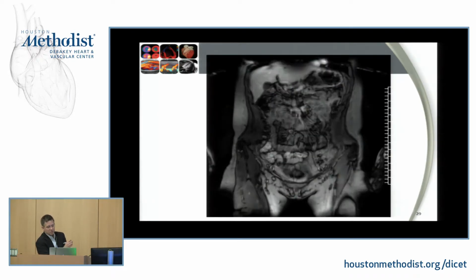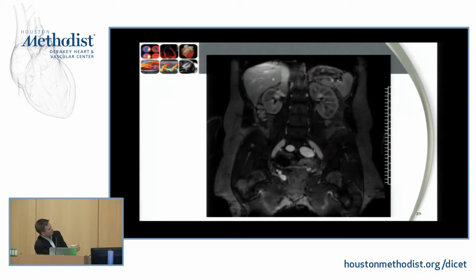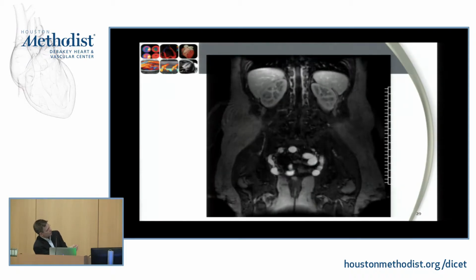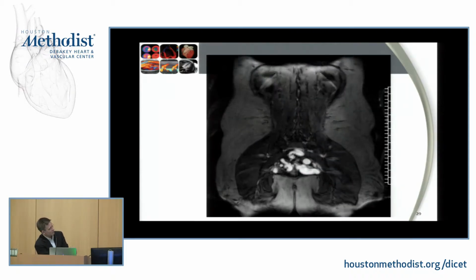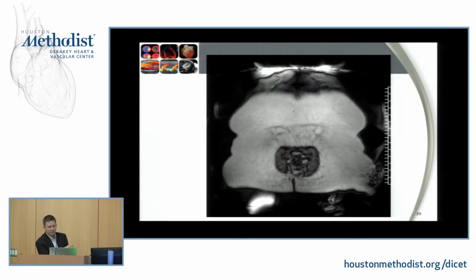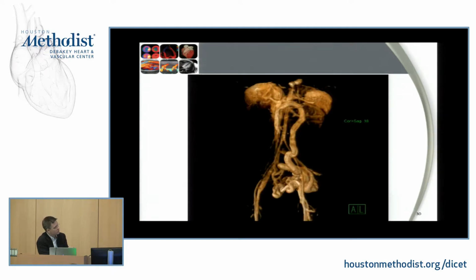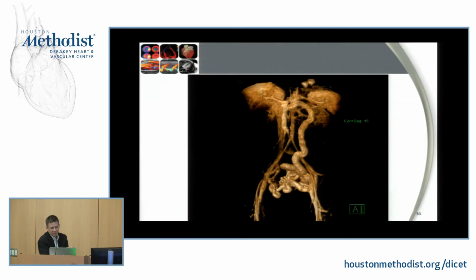So in this case, this is a patient that Jean had treated before who'd come in with some abdominal symptomatology and wound up having a tremendous AV malformation down the pelvis. She has these really hugely engorged veins down the pelvis that are far from normal. And using the imaging to try and figure that out, help them figure out where exactly this is coming from. Here are the reconstruction images, really a massive thing down the pelvis.